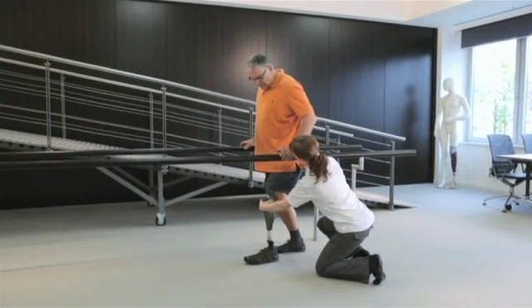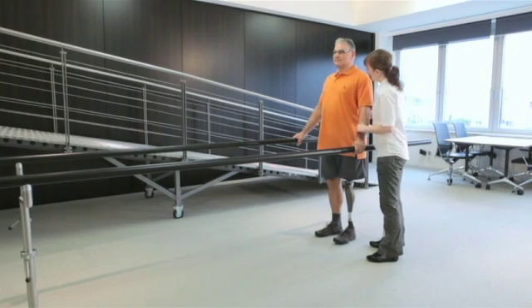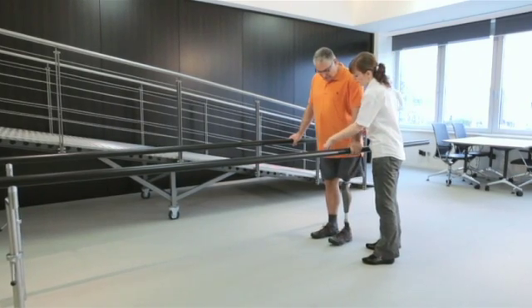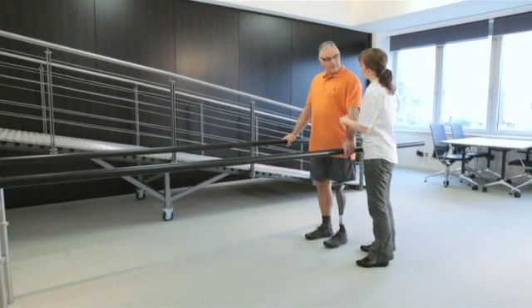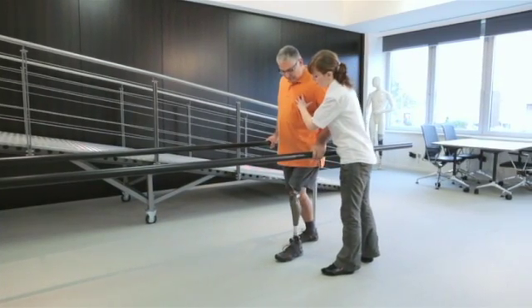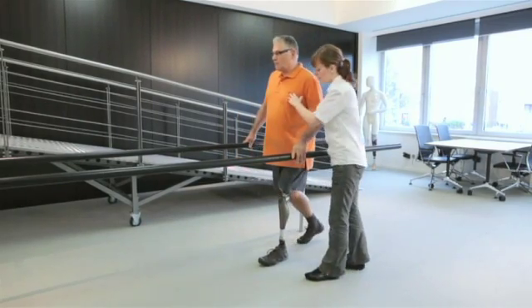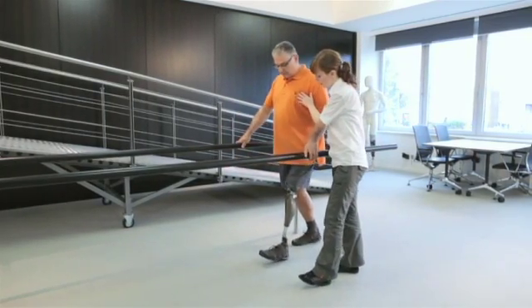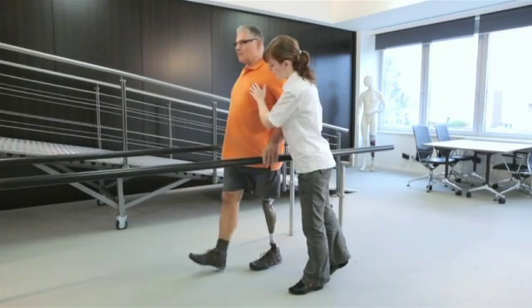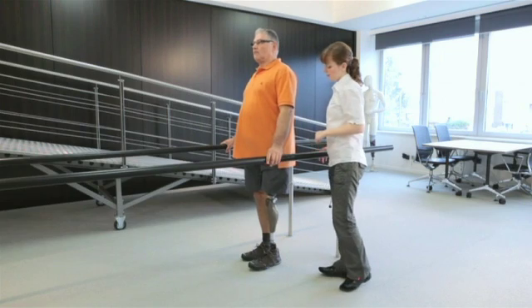Adaptive yielding control will provide the appropriate resistance needed. The user does not need to extend their hip to try to control the prosthesis anymore. Encourage the user to trust the preflex feature in the knee at heel strike and let him experience the smooth extension resistance that follows during mid-stance. The appropriate amount of extension resistance will be automatically provided.